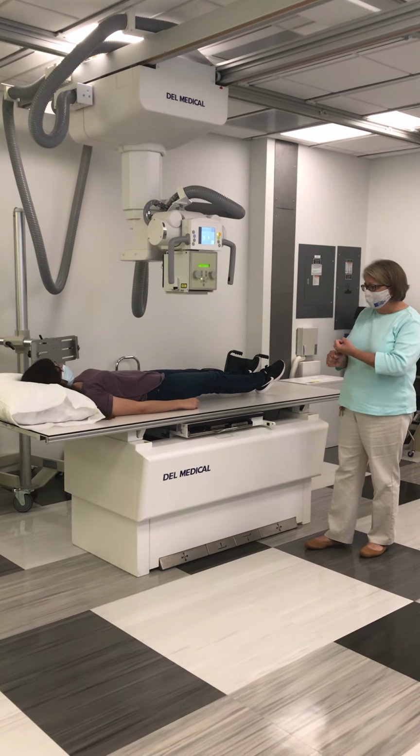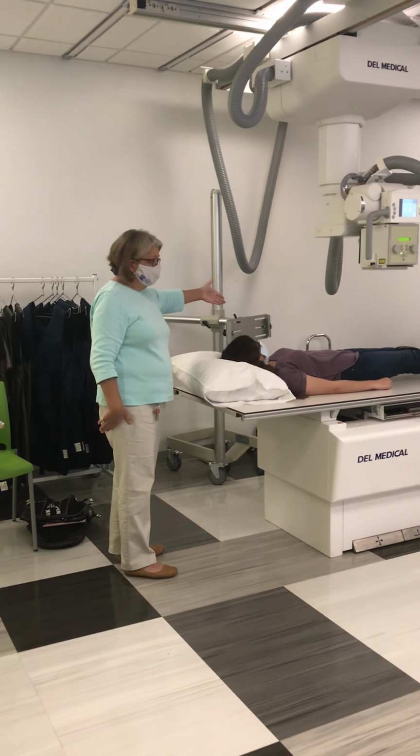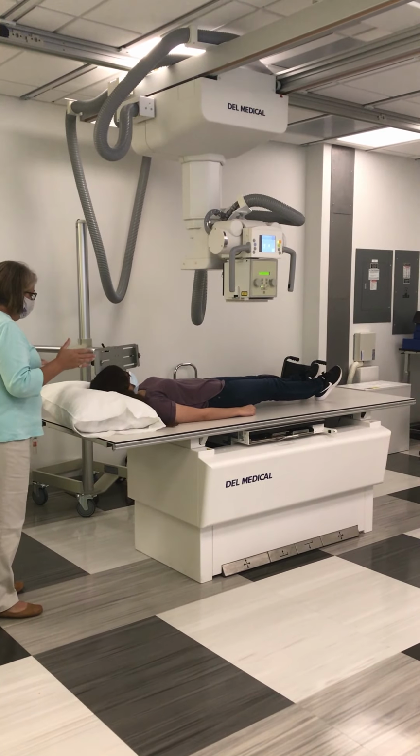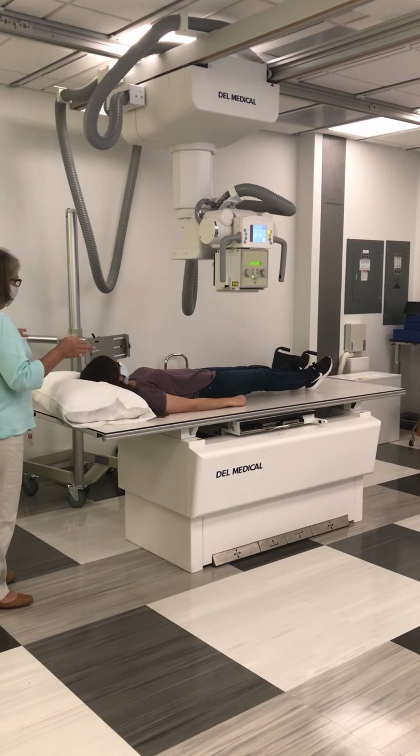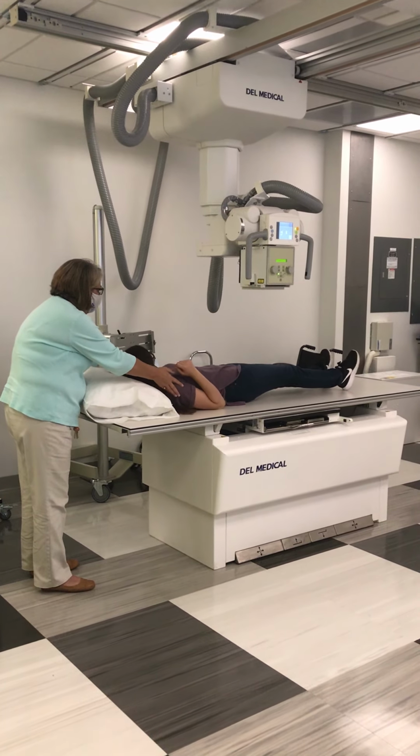To have my patient on the table correctly means that she is lying in the center of the table. So I should see an equal amount of space from her right hip to the edge of the table as I see from her left hip to the edge of the table. So we need to tell our patient, ma'am, I need you to scoot your whole body just a little bit to the right. There you go.